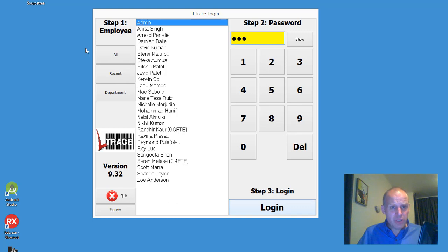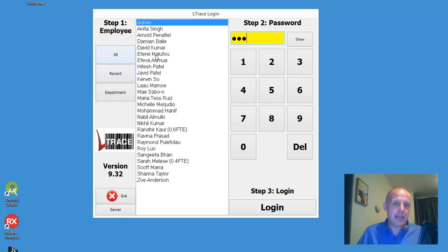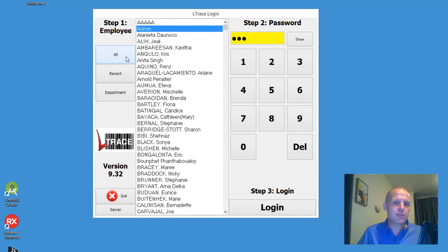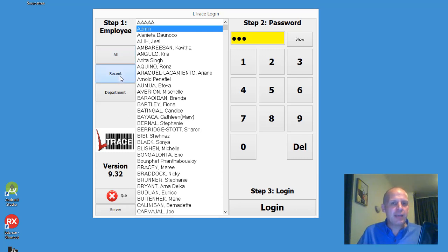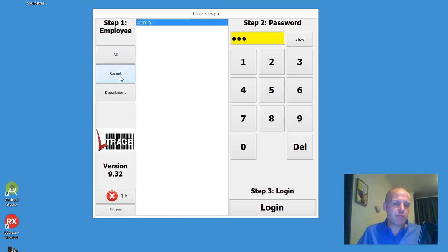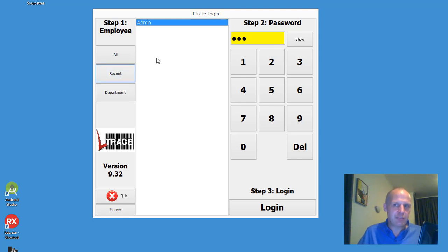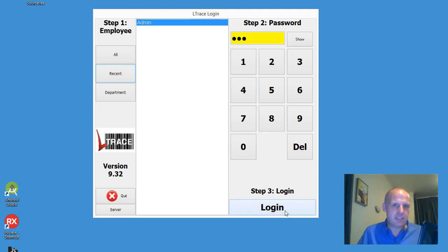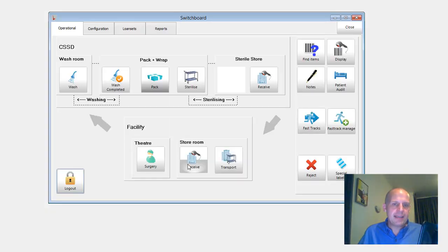But I've also got a couple of cheats just on the side here. So if you can't see your name in this list, press all and you'll see all the users of the system. And I've also got recent which is a really cool way of just if you're logging in and out of the same computer just go to recent and you'll be the only person in that list. Select yourself, press login.